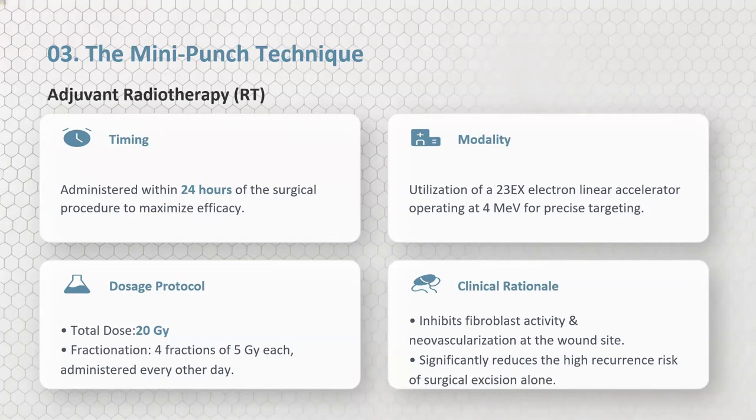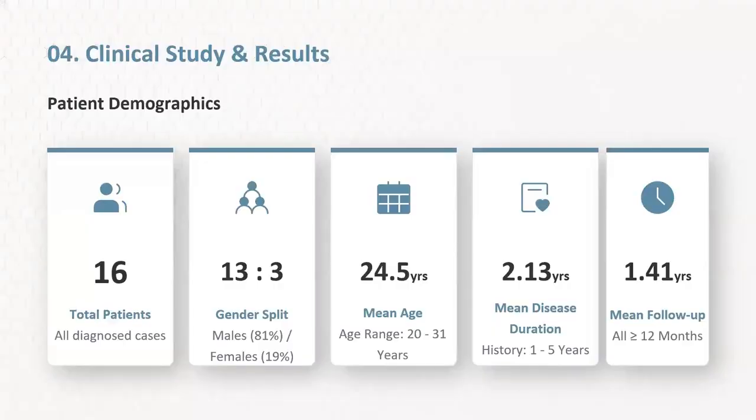A key part of our treatment is adjuvant radiotherapy. Given within 24 hours of surgery, we use an electron linear accelerator to deliver a total dose of 20 Gy in 4 fractions.